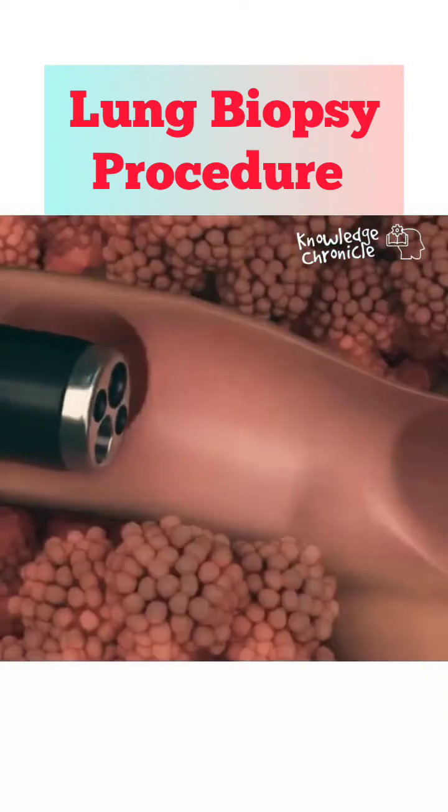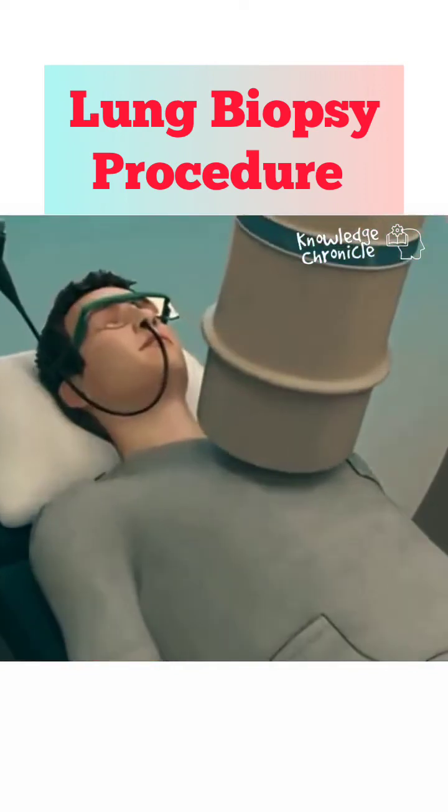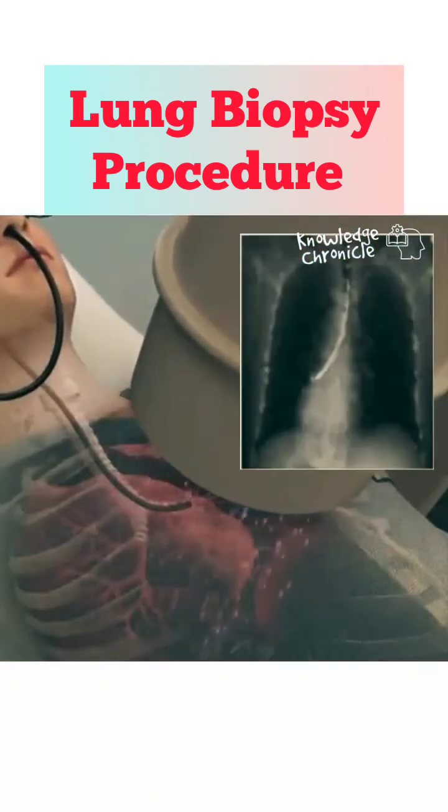Next, a flexible bronchoscope — a thin tube with a camera — is inserted through the mouth or nose and gently advanced into the windpipe and bronchi of the lungs. The camera helps the doctor locate the abnormal area for biopsy.